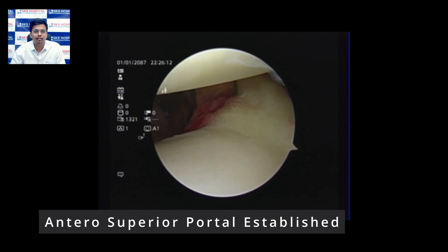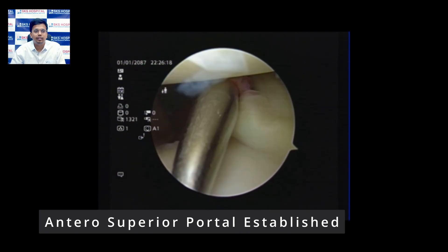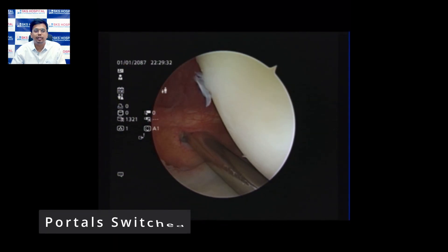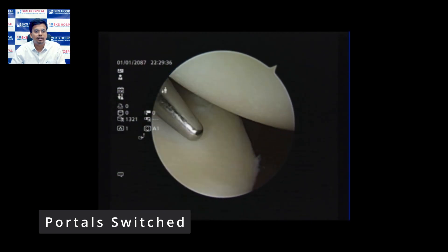Once the antero-inferior portal is established, we go for the antero-superior portal and repeat the same steps — passing the needle, then the knife, then the Wisinger rod. Once this portal is established, we switch our portals, viewing from the antero-superior portal, and establish the posterior portal by passing the Wisinger rod and then the cannula.